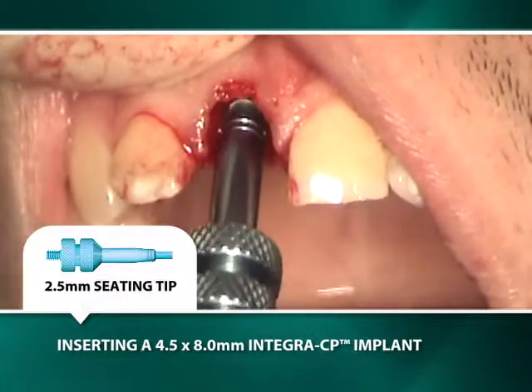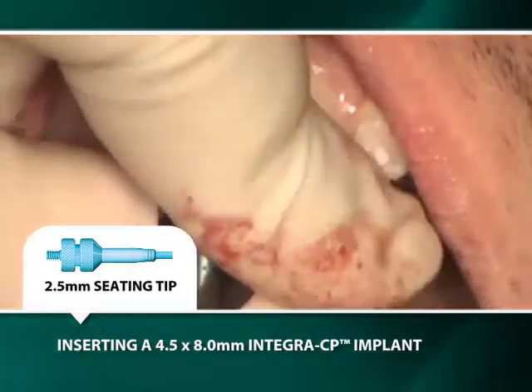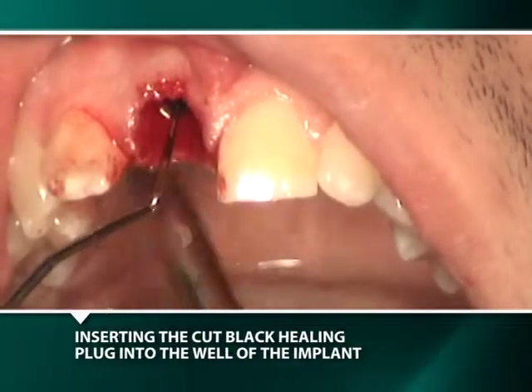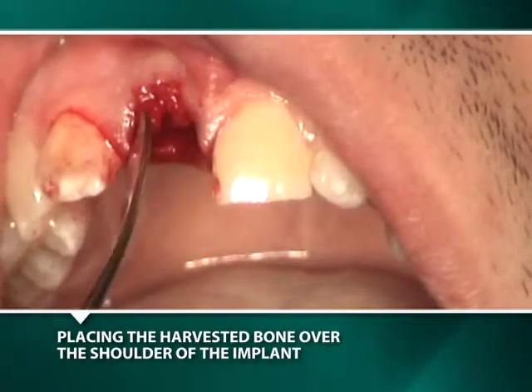A 4.5-millimeter by 8-millimeter Integra CP implant is transported on an implant insert or retriever instrument and twisted into the osteotomy. A cut black polyethylene healing plug is transported on a periodontal probe and inserted into the well of the seated implant.